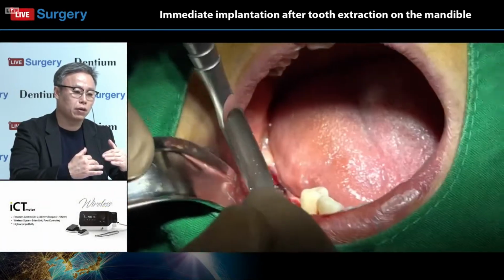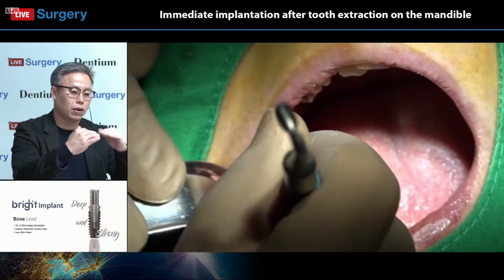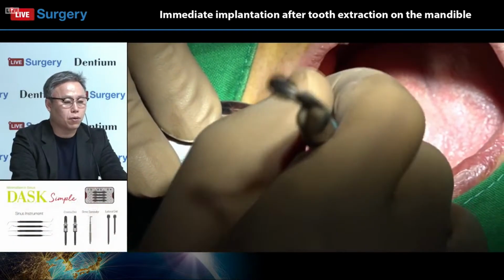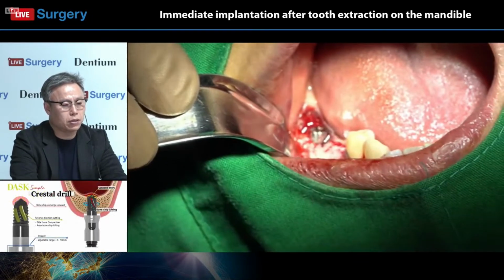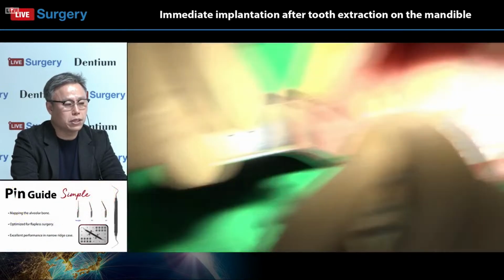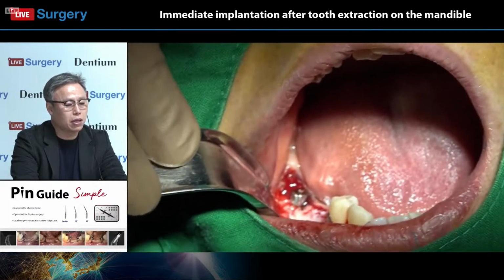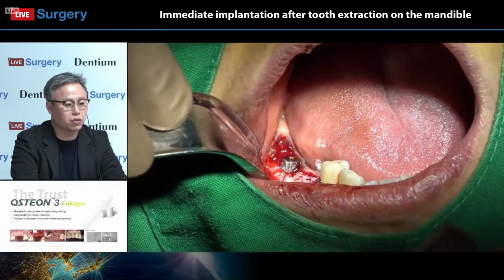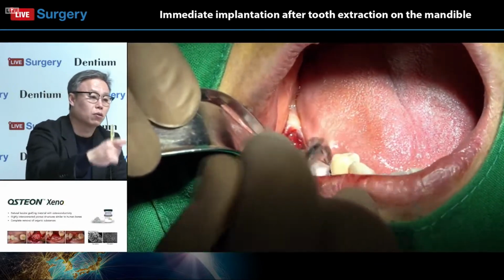Then we can expect good results after any bone graft procedure. Therefore, space maintaining is very good, and he's using the healing abutment for space maintaining. Another way we can maintain space is using the titanium reinforced non-resorbable membrane. But if you use the non-resorbable membrane, we need an additional surgical procedure to remove it. And also another disadvantage, he's using the collagenated bone graft.